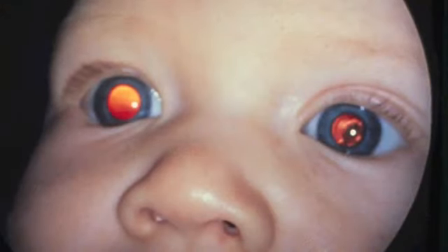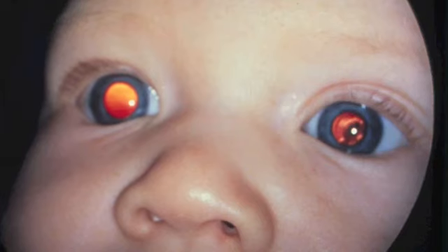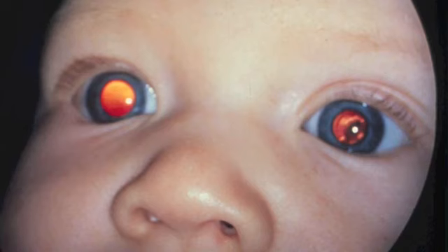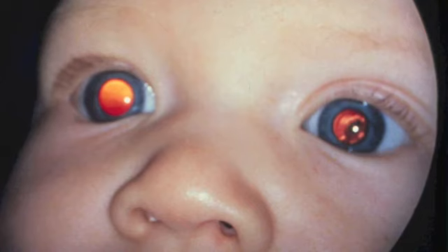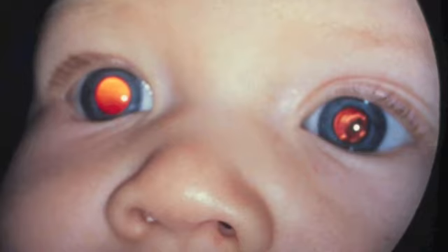This child has a normal red reflex in the right eye, seen on your left. Although it is a bit heterogeneous, yellowish at the top and more orange at the bottom, it is a normal eye. In the child's left eye, seen on your right, there is an obstruction to the light bouncing off from inside the eye. That obstruction is a cataract, which appears as a black spot in the red reflex. A black or absent red reflex can be caused by corneal scars, cataracts, blood in the eye, such as hyphema or vitreous hemorrhage. This can be a very ominous sign that requires urgent referral to an ophthalmologist.